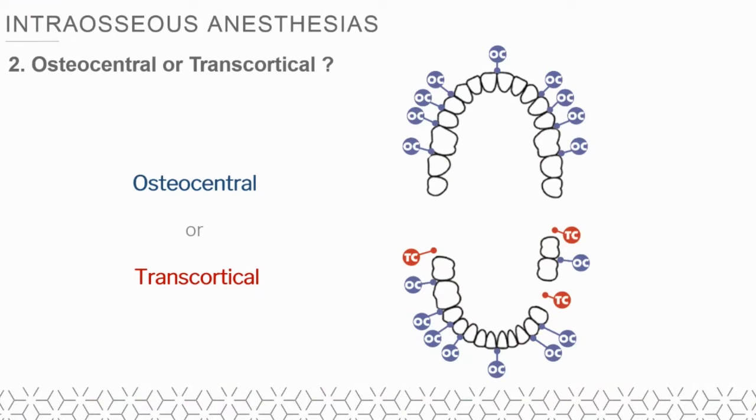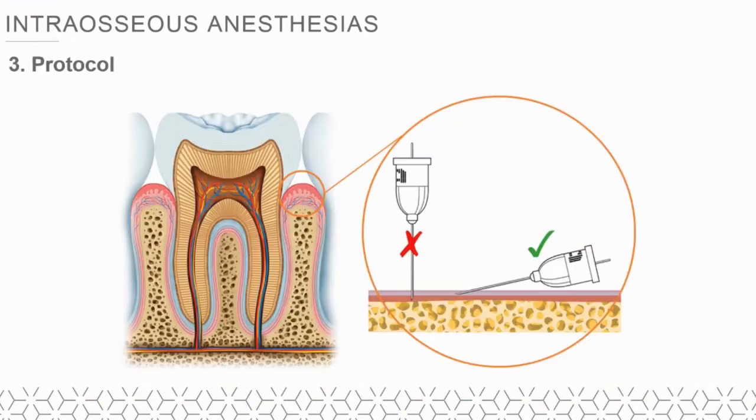Regarding the protocol, it is made up of 3 easy steps. Before starting, make sure that the device is set in I/O mode. The white LED should be lit on the handpiece. Position the D mark on the needle hub in the window of the lip protector. Then present the needle with the D facing directly opposite the gingiva towards the base of the papilla, with an angle of approximately 15 degrees compared to the tissues. The first step, consisting of the anesthesia of the attached gingiva, is paramount regarding the painless anesthesia.